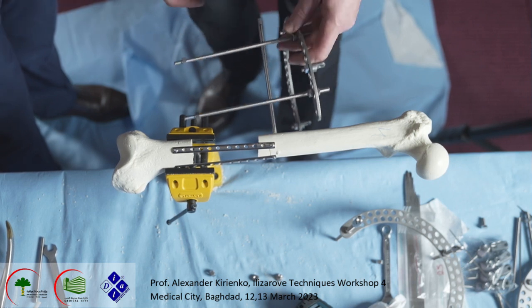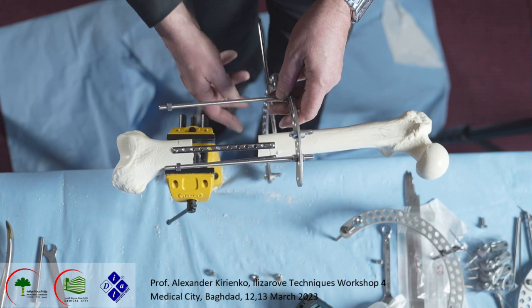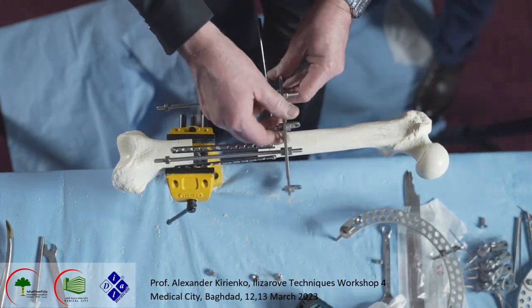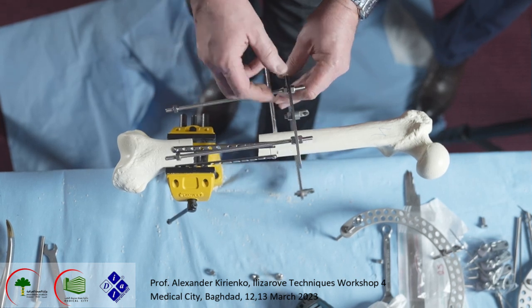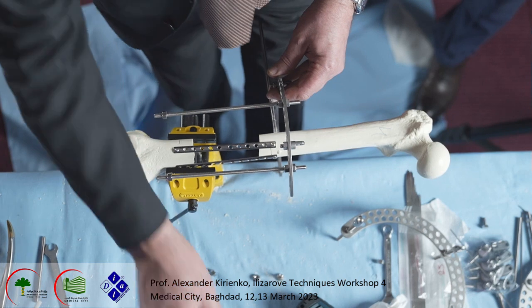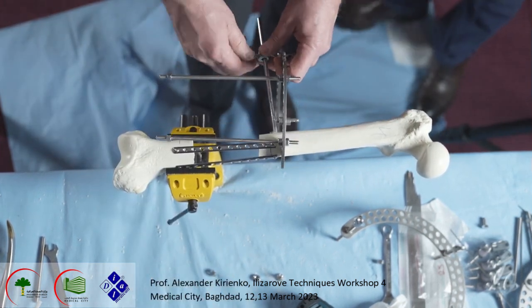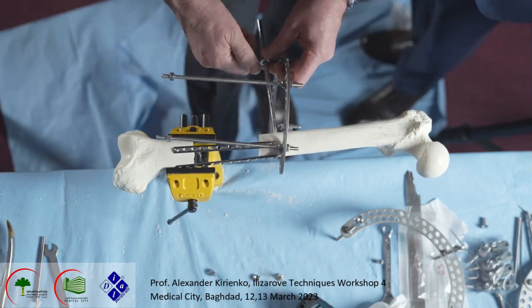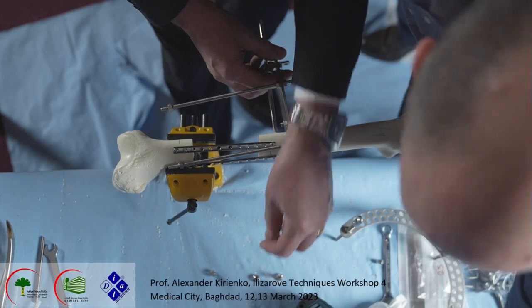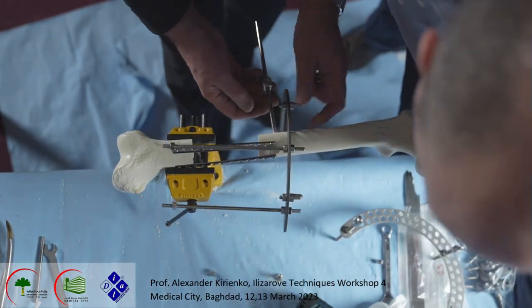After that, it's not easy to understand how to position this because we need to calculate soft tissue, swelling, and how the patient stays. But I think we start doing like this. We put this half pin here. We attach it to the ring, and it's maybe medium with the nut.